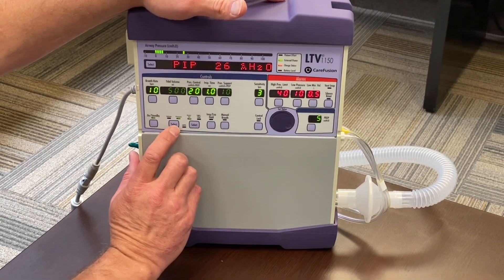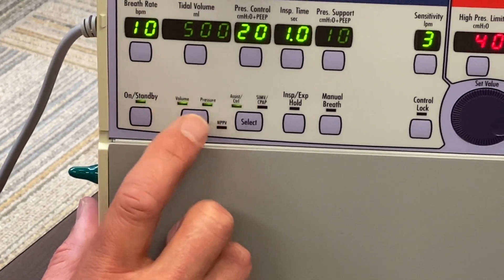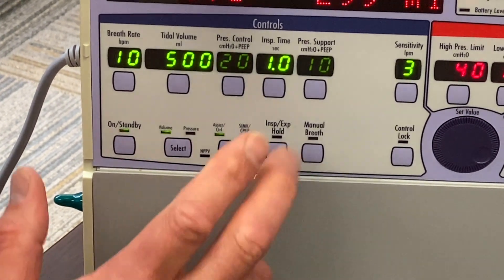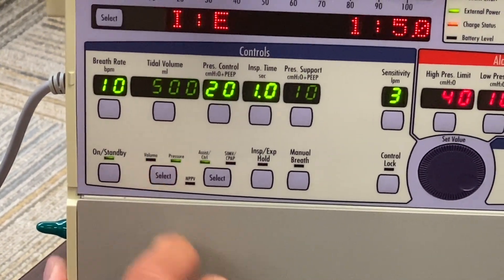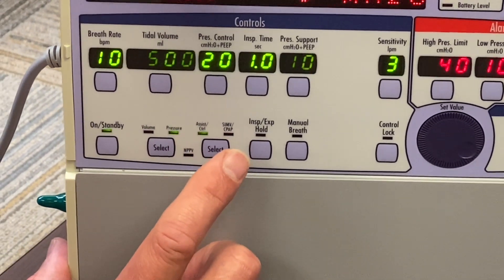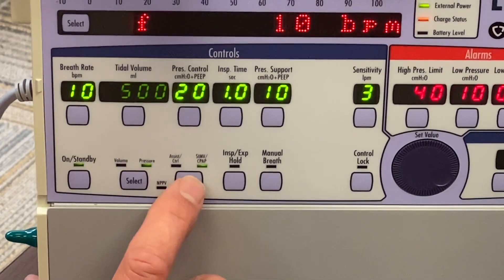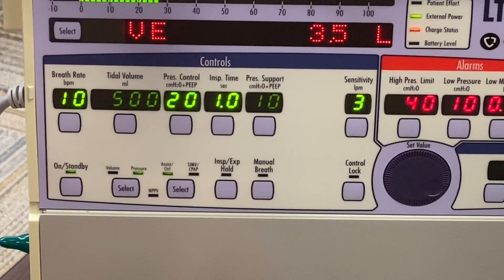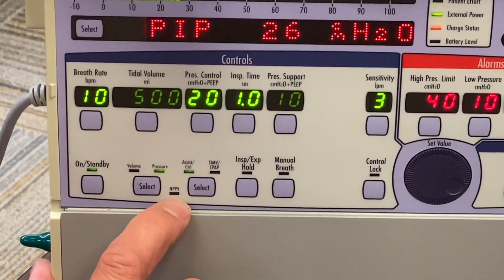Right here you select between volume and pressure modes. When making a selection, you'll get a blinking light — press again and it'll confirm that selection, then you'll have the new controls corresponding to whatever you selected. The same applies to the ventilation modes. In these modes you have Assist Control, SIMV with CPAP, and also NPPV.